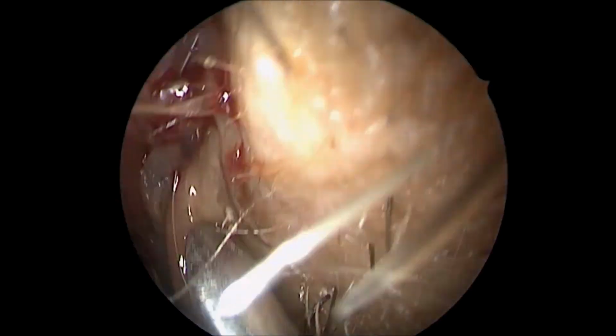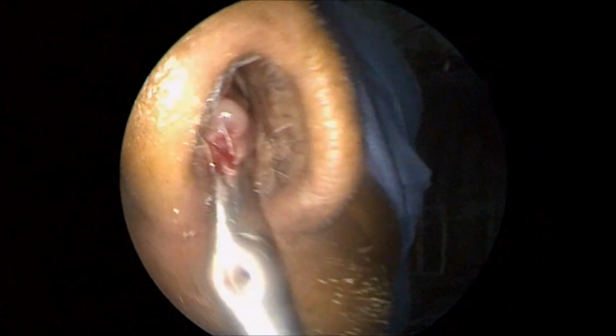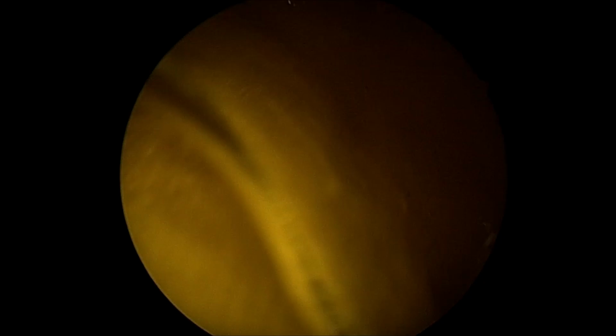That's a mass. Papillomatous-looking, polypoidal mass. Later, the histopathology came out as an inverted papilloma. Of course, we didn't do any preoperative biopsy.